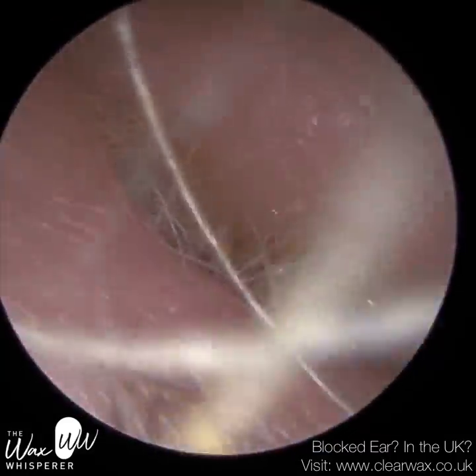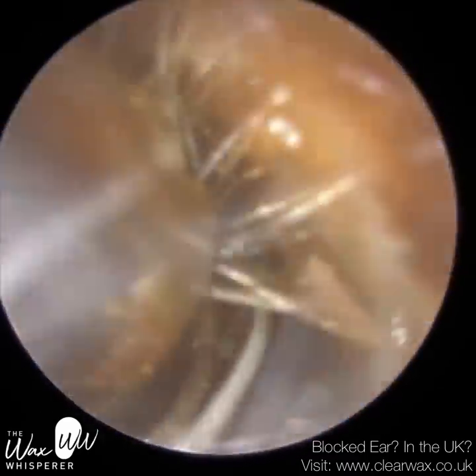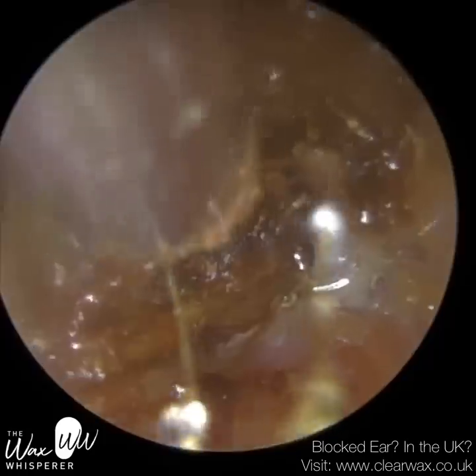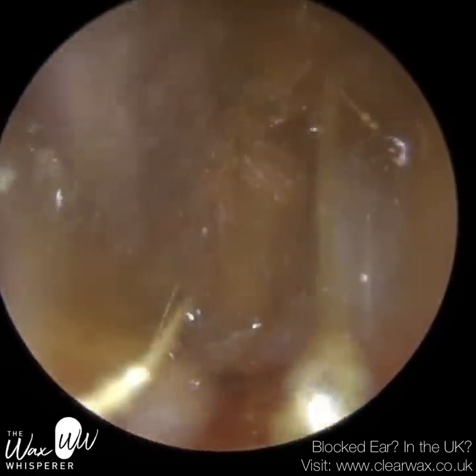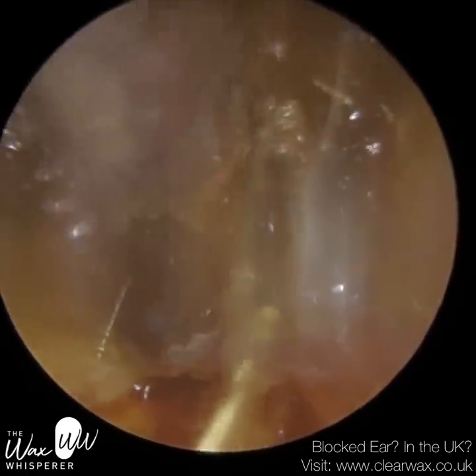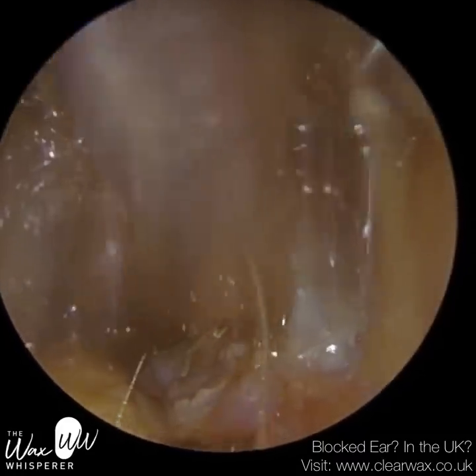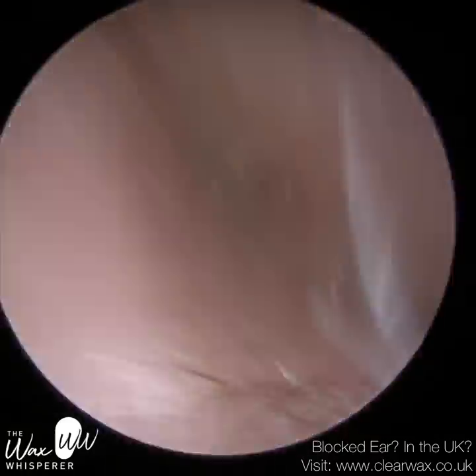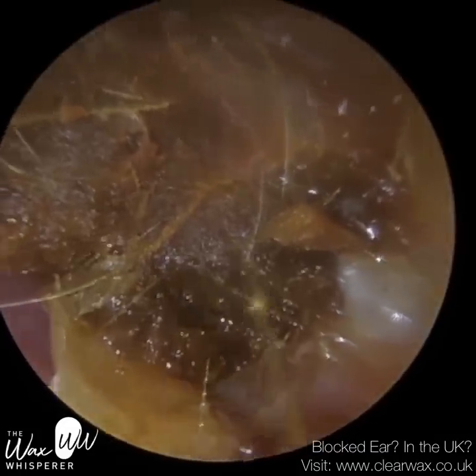This plug of dead skin, these dead skin sheets, fails to migrate and falls upon itself, forms a plug, and just gets bigger and bigger. As the next layer of skin lying in the ear canal dies, it again doesn't shed, doesn't migrate, and attaches itself to that plug, and so on and so forth. This plug of dead skin can get so big and exert so much pressure that it can start to widen and change the shape of the ear canal.